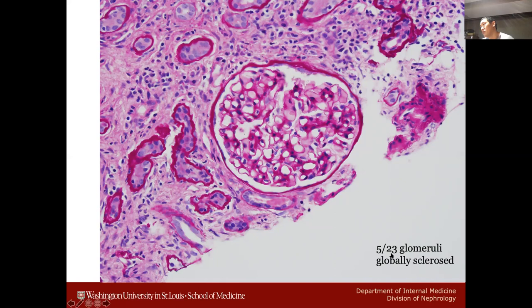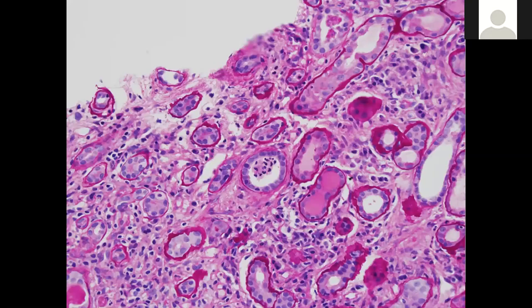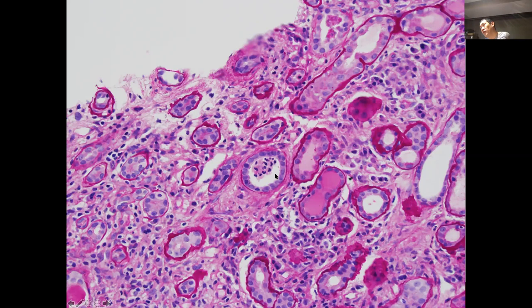There were 23 total glomeruli in the sample; all look good except for five, which were globally sclerosed. On this PAS image, there appears to be a cast in a tubule around three o'clock. That looks cellular with nuclei — so that makes it a white cell cast.